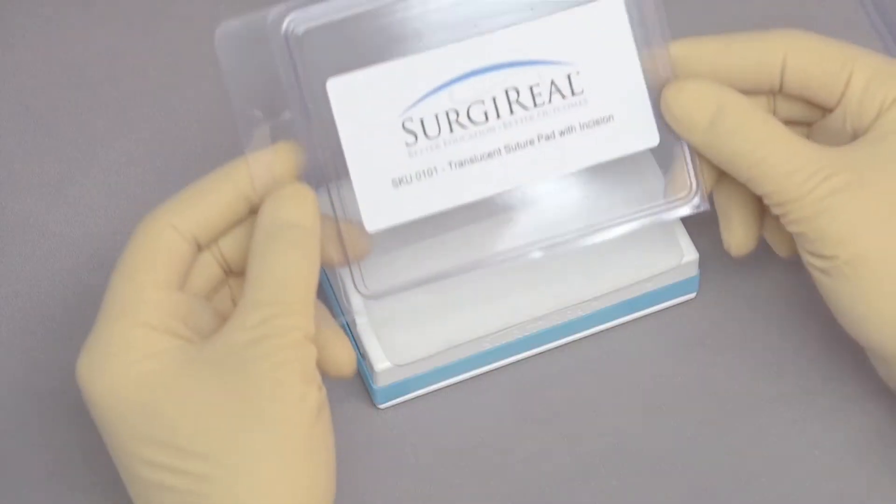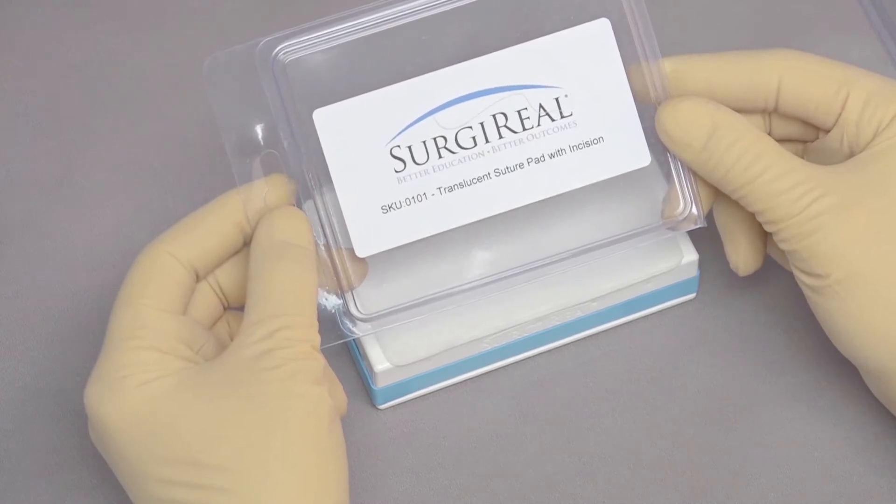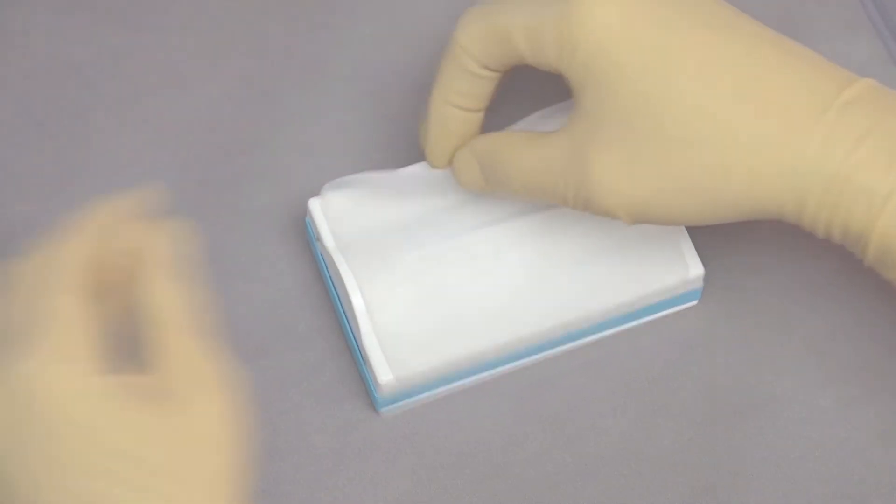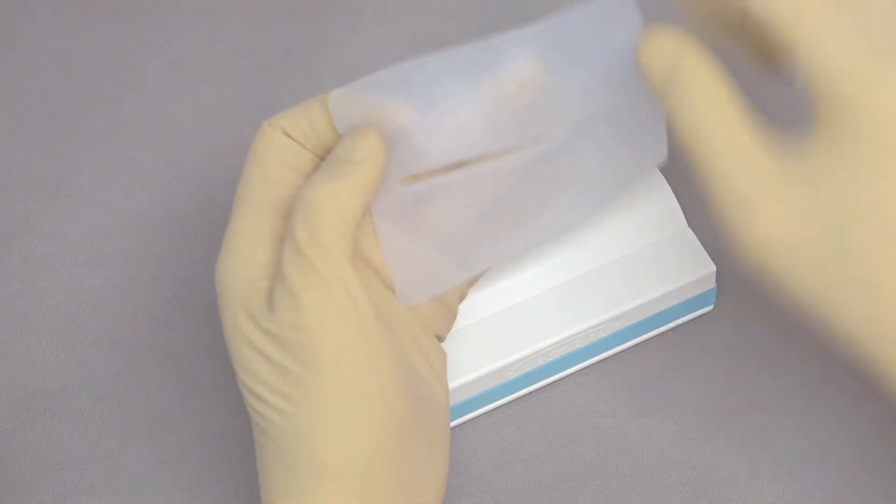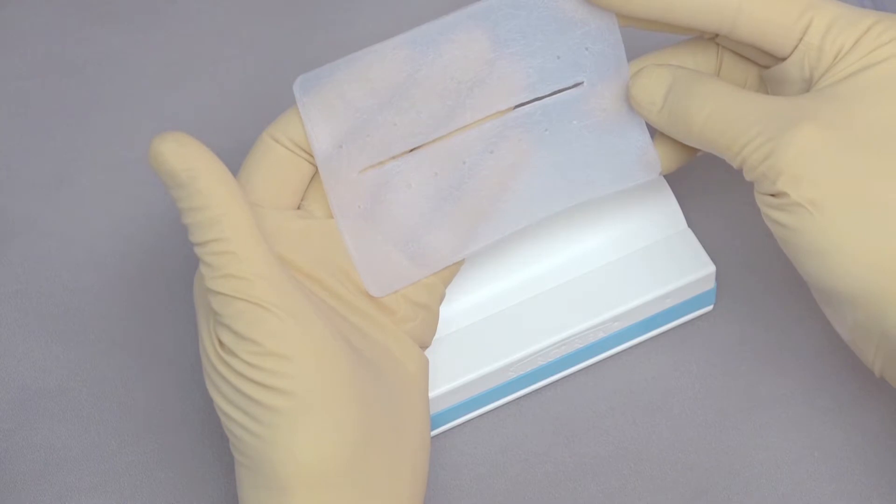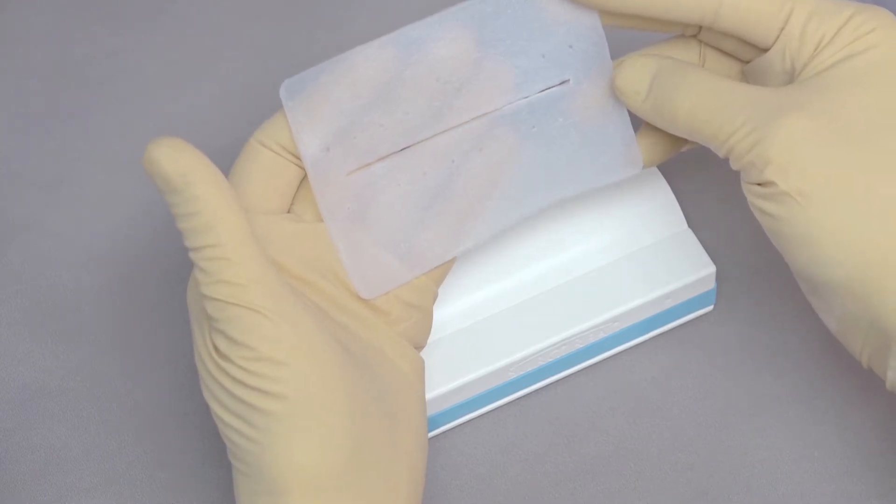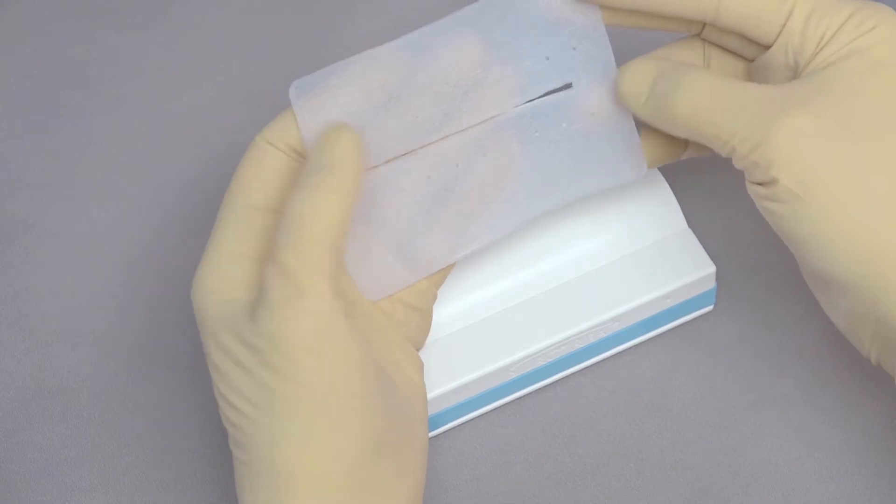Today we're going to practice suturing using a surgical translucent suture pad that has a pre-made incision. If you look at the pad, it has little holes in it to represent evenly spaced dots that you can use either to place your suture needle through or use to determine whether your suture bites are even.